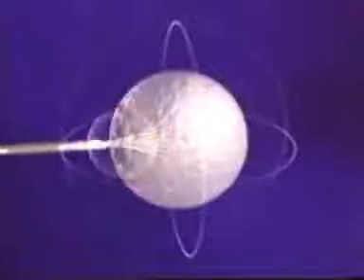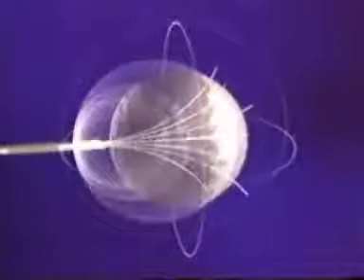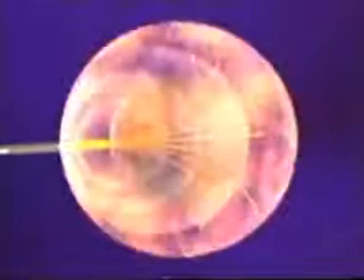The ablation occurs in stages over time. Initially, the heating occurs immediately adjacent to the electrodes and later is conducted to the surrounding tissue, creating a spherical ablation. Deployment is also staged to create the ablation more efficiently.